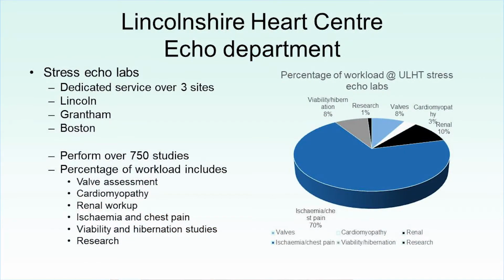The Lincolnshire Heart Centre, like any echo department, has a dedicated stress echo lab, which is set up over 3 sites at Lincoln, Grantham and Boston. These are represented not just by me, but also by part of the team, the expert physiologists amongst the expert consultants that lead. We perform over 750 cases, and our percentage load is listed here. If you look very carefully, about 70% of it is ischemic heart disease.